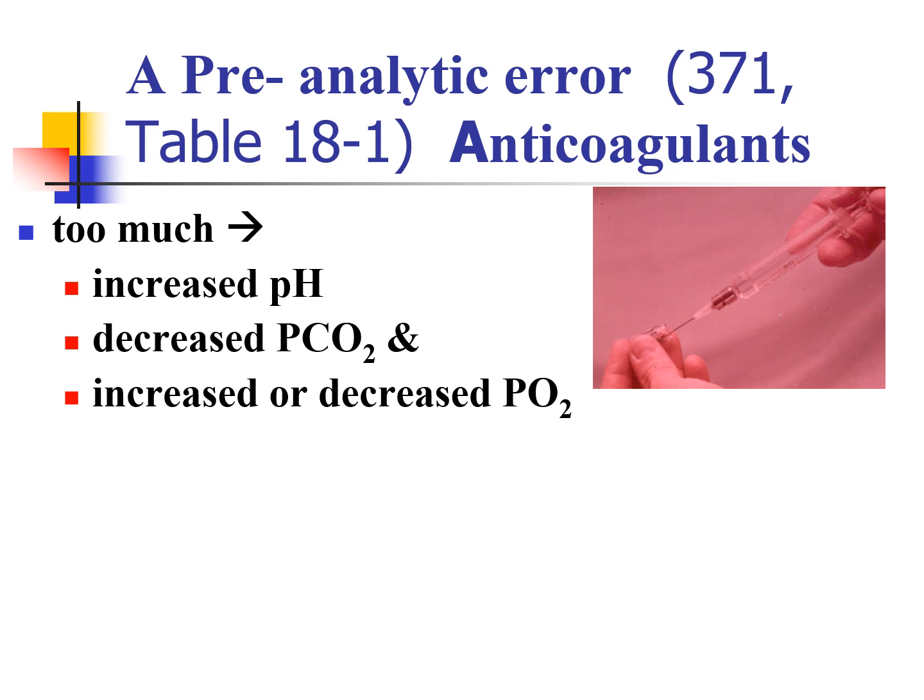The CO2 will decrease, and there can be either an increase or decrease in their PO2, depending on what's going on with their gas results and what's in their blood to begin with. So the big thing here is you need to remember if there's too much anticoagulant or too much heparin in that syringe, like a little ball of heparin, it will increase your pH, alkalotic, and decrease CO2. Well, if your CO2 is decreased, what's going to happen to your pH? It'll go up, right? So as long as you remember that it'll turn them alkalotic with the CO2 and pH, you're good to go there.